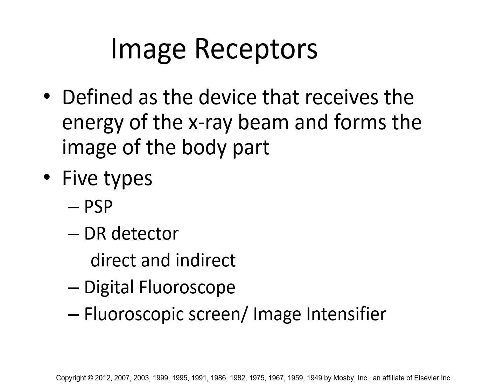There was a little bit of lag in adopting the new technology, because it's a capital purchase. You've got to tear out your film processors and purchase new processing equipment for these new PSP systems. So it didn't make sense, especially for a smaller facility, to overhaul your entire film system and adopt PSP until they started messing with the reimbursement rates.